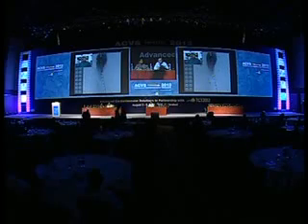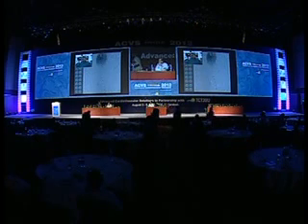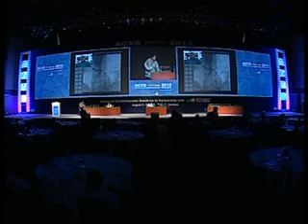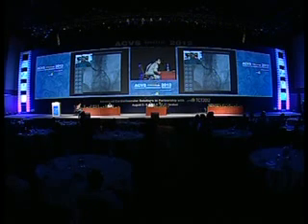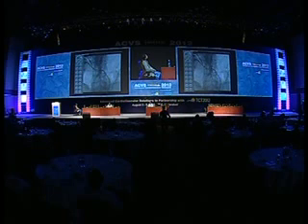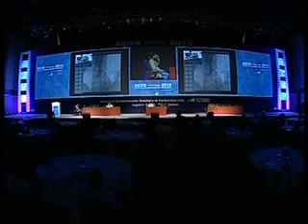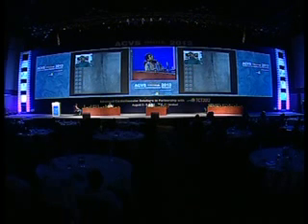So what we have done now is a baseline angiogram. So hopefully we'll seal at both these places. We want to be sure that we start our device as high as possible. So what I've done is I've got a catheter from the other groin positioned at the ostium of the right renal artery, and I've stabilized it with a wire. When I test from here, I'll know exactly where the right renal is. And then from the left groin, I've taken in the Endurance device, and it is now in place, ready for deployment.